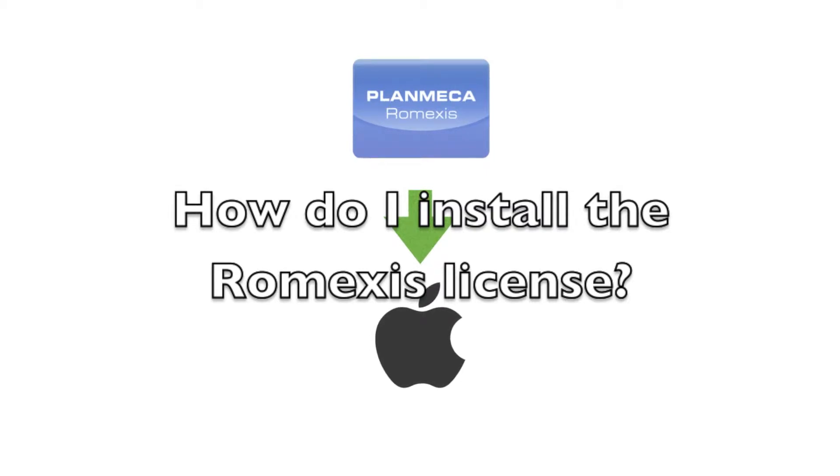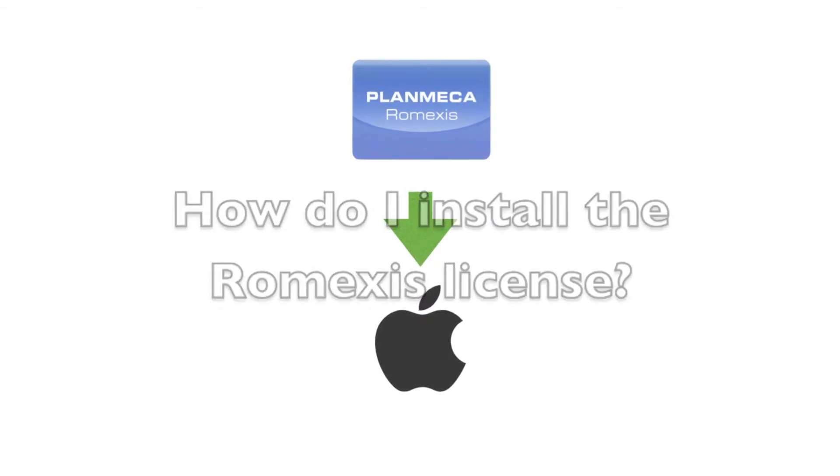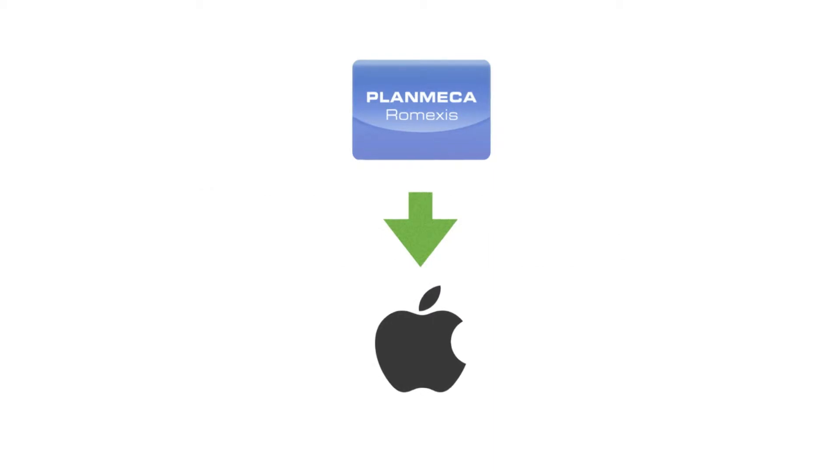Why do we need a Romexis license? If you're familiar with this software, you know that in every situation where we install Romexis there has to be a server and then there can be clients. The server is going to handle storing images, and the clients are going to connect to that server and be able to open those images.